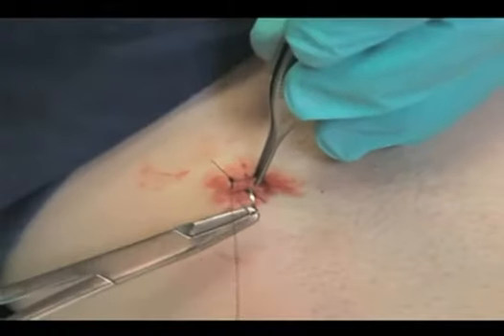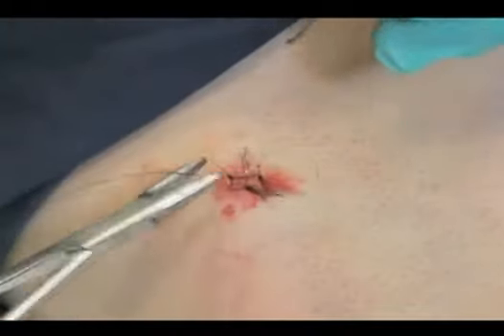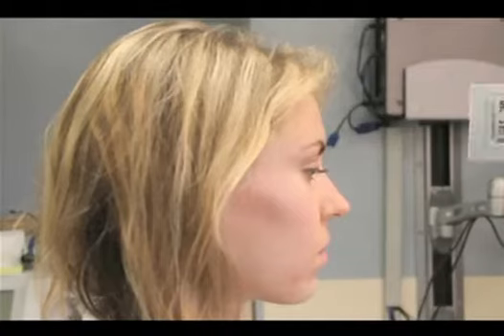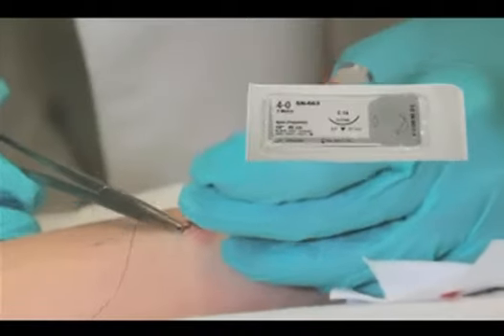This option also has the added benefit of not requiring the patient to return for suture removal. For larger biopsies, the wound should be closed with a non-absorbable suture such as nylon or polypropylene. In general, for thick skin such as the skin on the back or volar skin, a 3-0 reverse cutting suture is advised. A 5-0 suture is recommended for the face, and a 4-0 suture for the rest of the body.